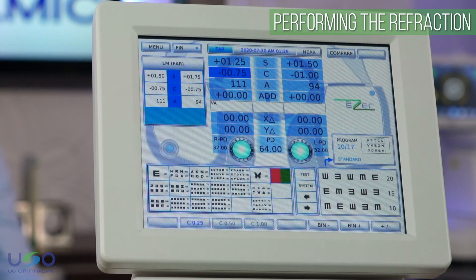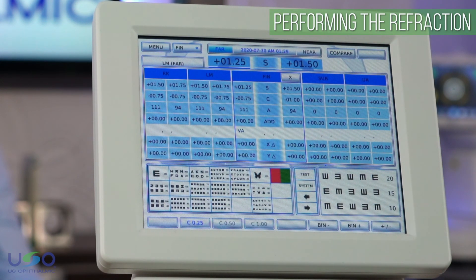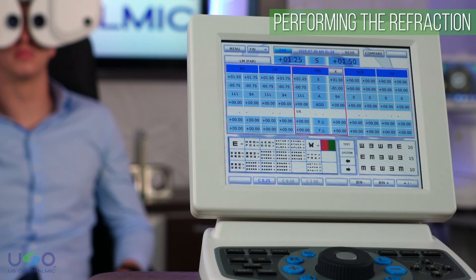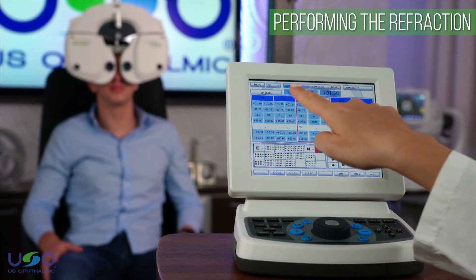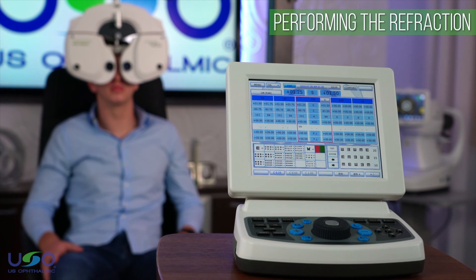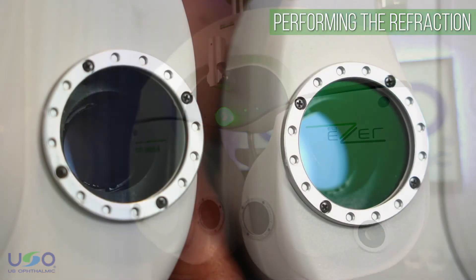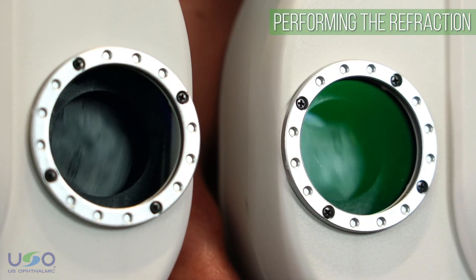The Easer EDR-9000 has the ultimate compare function. This function lets the doctor show the patient the difference in vision between their previous and new prescription by simply selecting the old and new prescription measures on the screen. This unique functionality will leave patients impressed and convinced of the importance and value of their new glasses. This one-of-a-kind feature is only available in a digital refractor like the Easer EDR-9000, which can interchange lenses instantaneously.